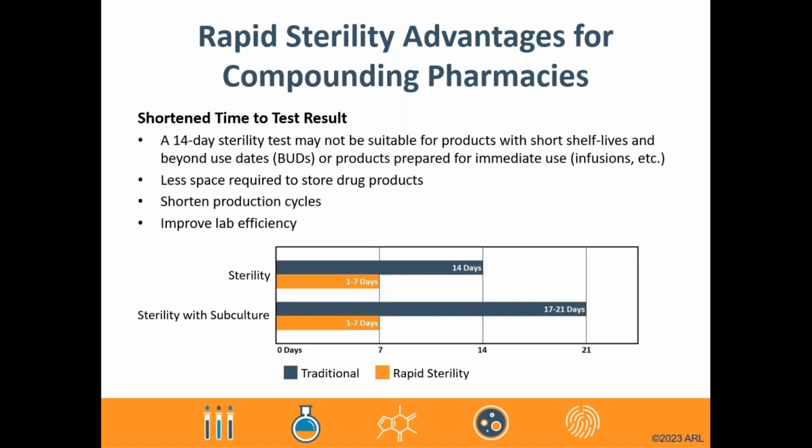This testing can also result in reduced waste due to products exceeding their BUD while sitting on shelves or in a warehouse somewhere. These efficiency gains also create further benefits by allowing firms to more rapidly respond to their patients' or their clients' needs or requests.